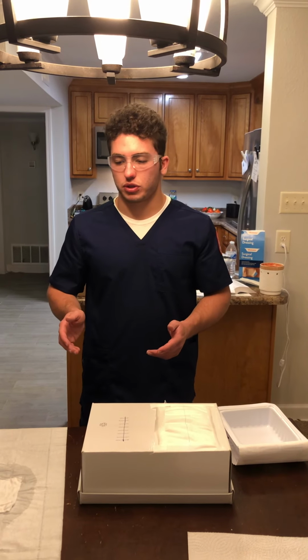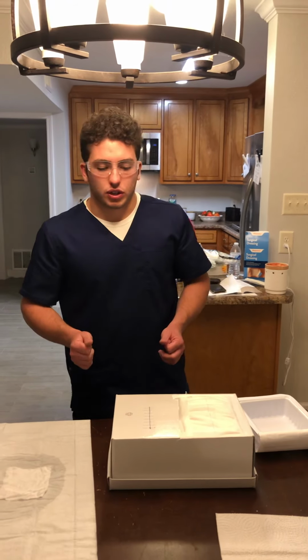I am also going to perform hand hygiene, and I'm going to dispose of all of my equipment that I used for the procedure. I am going to note when the procedure is over that the open wound had an orange reddish serosanguinous fluid, moderate amount. It had a water-like consistency and no odor. I'm going to note that the suture line was intact, the edges were well approximated and closed, no drainage and no odor, and the patient took the procedure quite well. No tenderness or pain was noted.